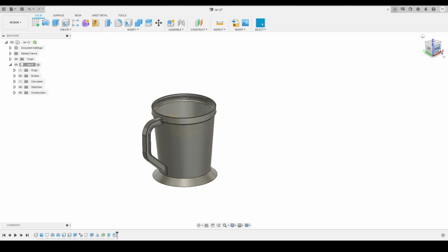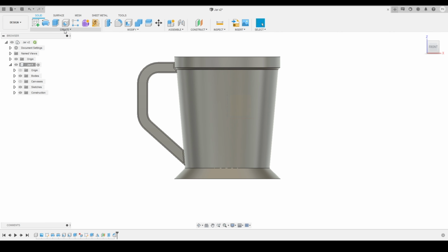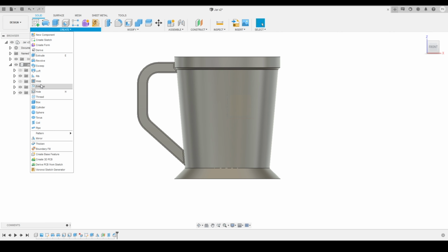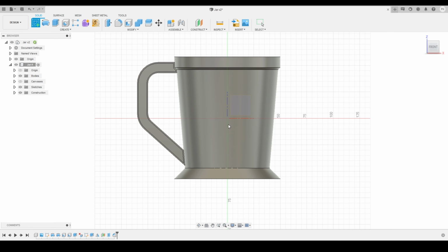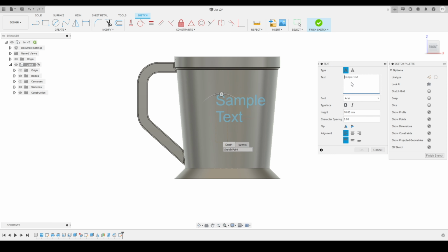Now we'll go on to the front view over here. Here you can see, we'll turn on the origin, and we'll go into the create panel, where we got a tool called create a sketch, and we'll activate this plane, and here you can see the tools are active. Now we'll go into the create panel again, we'll activate the text tool, and we'll try to write a text over here, because we want some markings on the body that will help me to decide the level of fluid or water inside the jar.